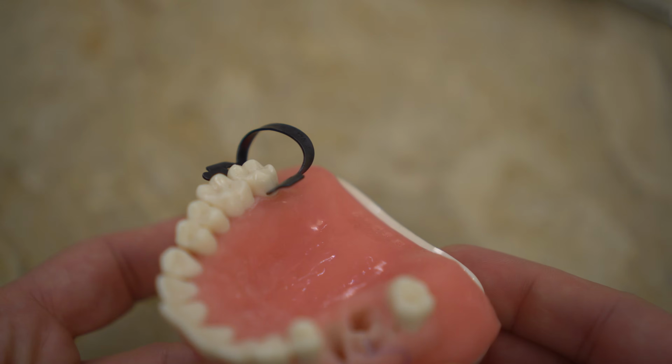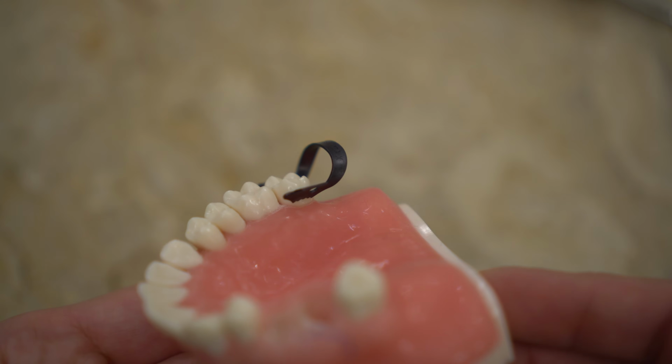As you can see on the picture, the palatal and lingual side of these clamps sit higher on the tooth as well, which means you don't have to give LA palatally or lingually when using these clamps. And even if you do end up giving LA, you're not causing that much damage to the tissues, so it's more comfortable for the patient after. Since I started using these clamps, I find molars so much easier to clamp.